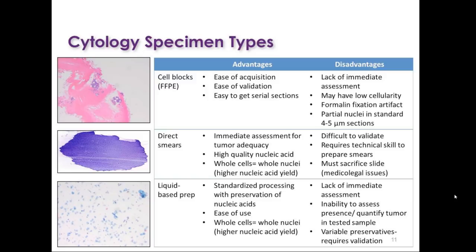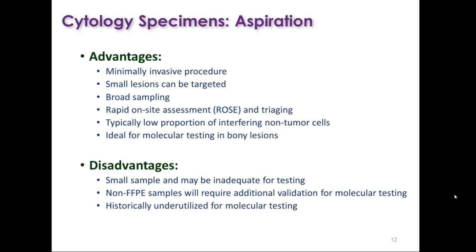Liquid-based cytology has the issue where you cannot assess upfront the presence of tumor or quantify the amount of tumor there. And also, because it's a different media, you will have to validate again independently from your FFPE samples. So as far as FNAs go for molecular testing, these are great procedures because they're minimally invasive.